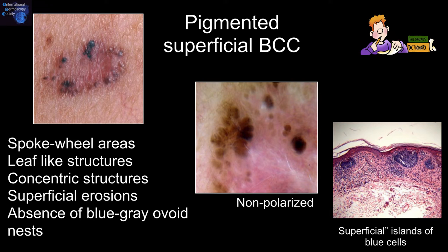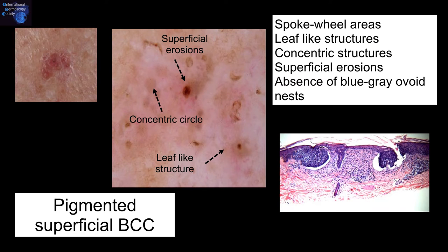Pigmented superficial basal cell carcinomas — the features we look for include spoke wheel areas, leaf-like structures, concentric structures, superficial erosions, and the absence of a blue-gray ovoid nest. Here we have a pigmented superficial basal cell carcinoma showing the concentric circle, a leaf-like structure, and a superficial erosion.